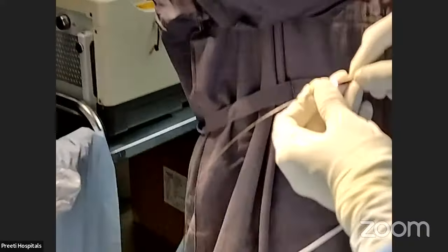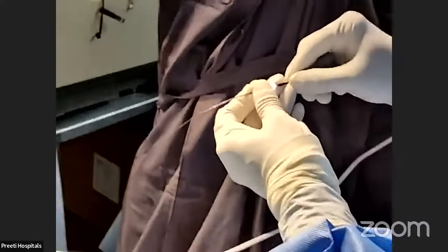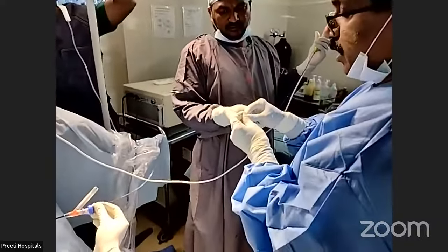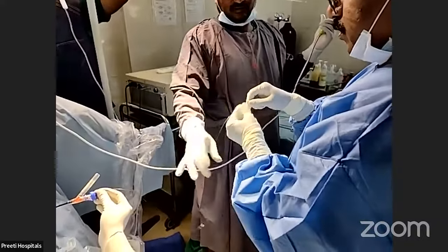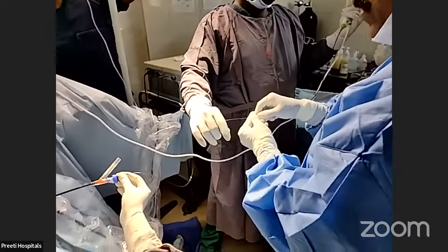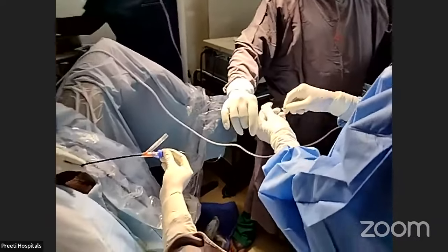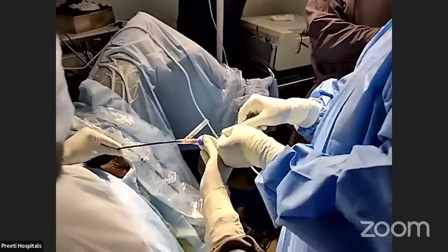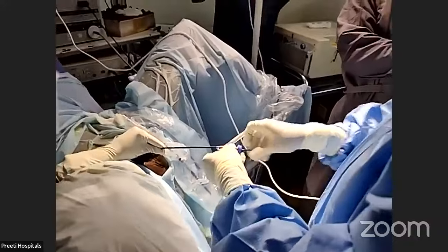So the one lesson we have learnt is this: post-stented also, it may not go easily, but we will have some edge. I am passing this guide wire. Why am I passing this guide wire? I wanted to start the water also. Water goes through the flexible scope. Now I am passing the access sheath over this.